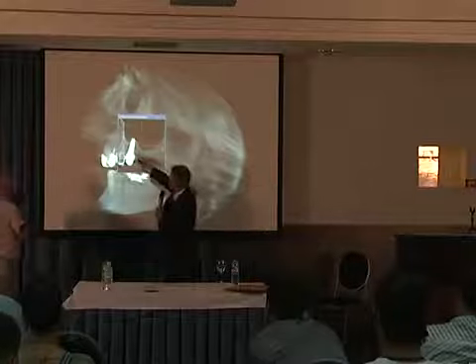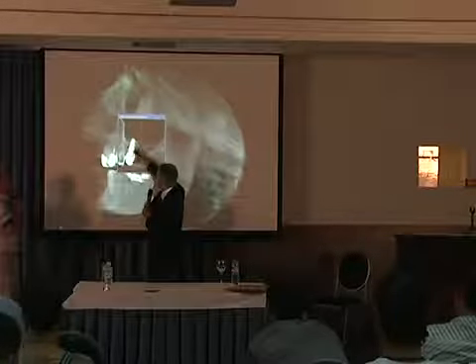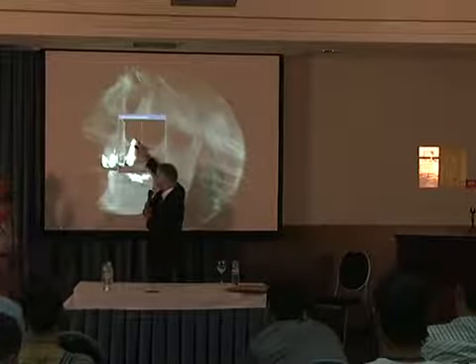ago. 5 years ago we find some remaining augmentation material, but only around the implant.